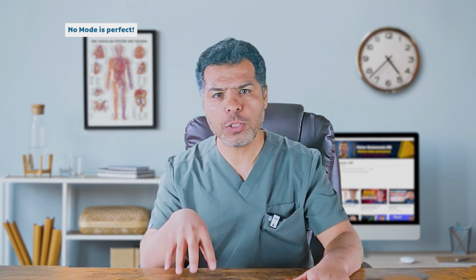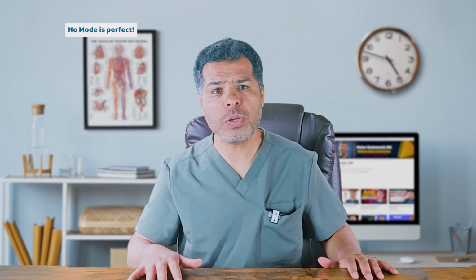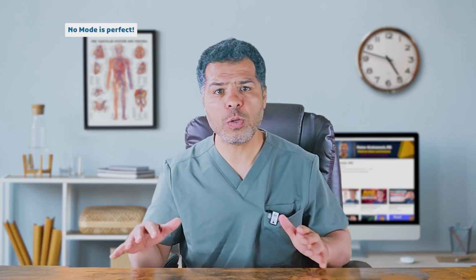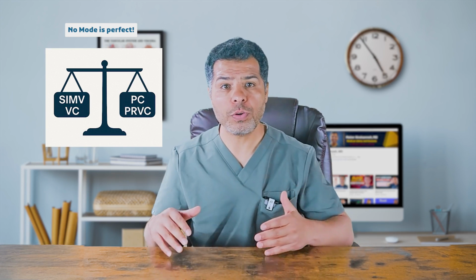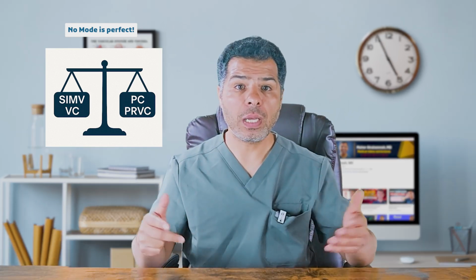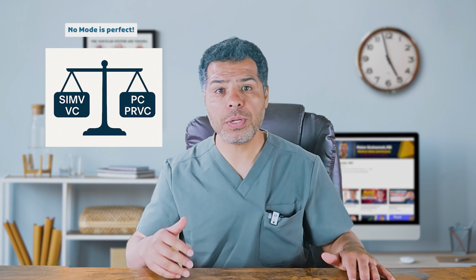Now, SIMV, synchronized intermittent mandatory ventilation, is essentially a blend of VC or PC with pressure support modes. I won't dive deeper into SIMV here as I rarely use it in clinical practice today, and there is no strong clinical justification for choosing it over other modes. In fact, current evidence does not support the superiority of one mode over the other in terms of clinical outcomes for patients with acute respiratory failure or other critical care conditions.